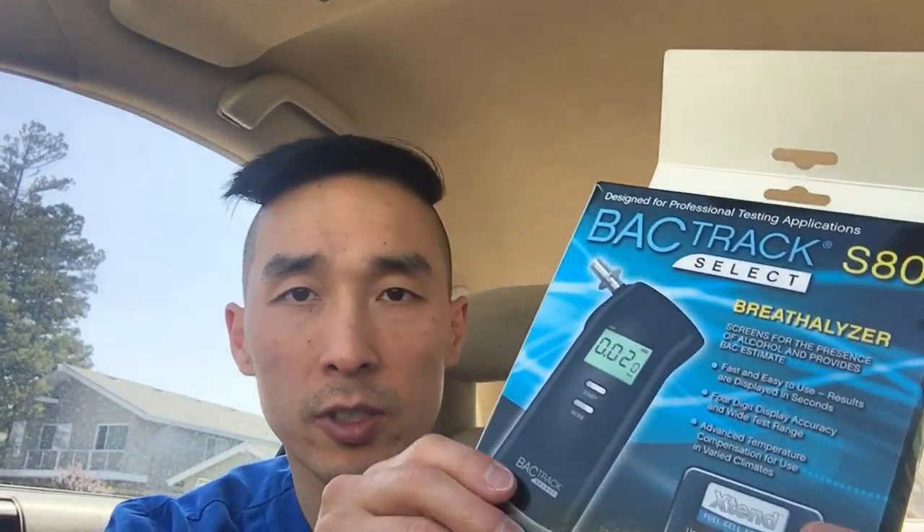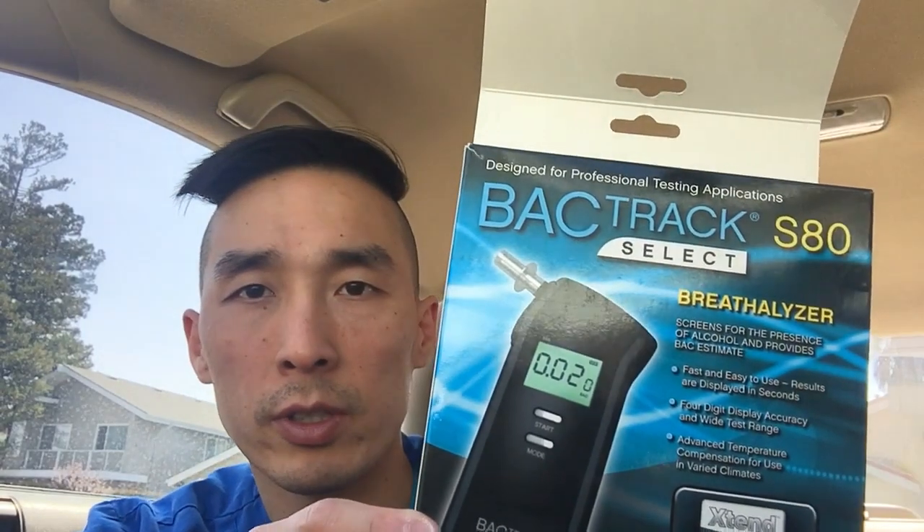Hey, what's going on everyone. I wanted to do a product review on something I've had for a while and it just didn't cross my mind to review it, but I think it's very important. It's always good to be responsible, especially if you're drinking. You definitely should not be drinking and driving for obvious reasons, but in order to check your blood alcohol content prior to driving so you don't get a DUI and endanger your life and other people's lives.